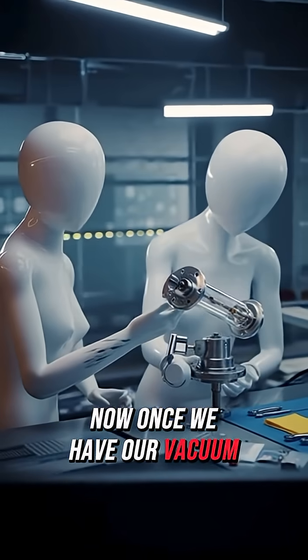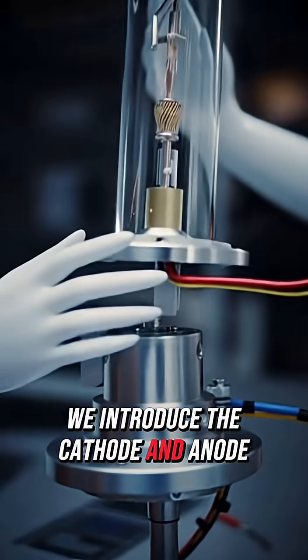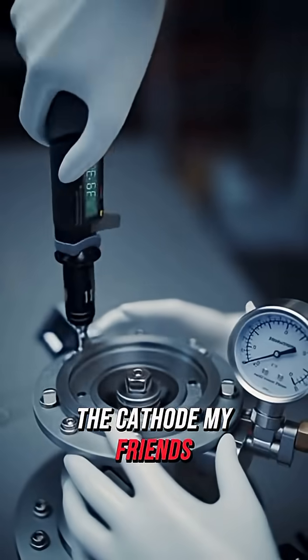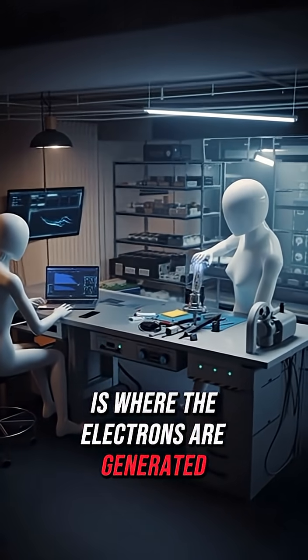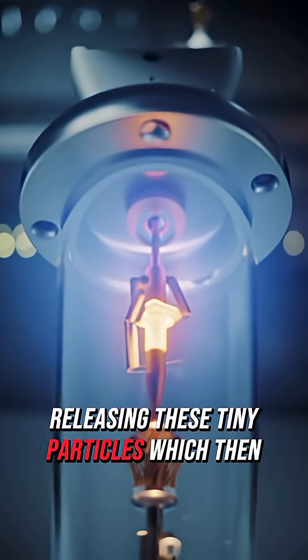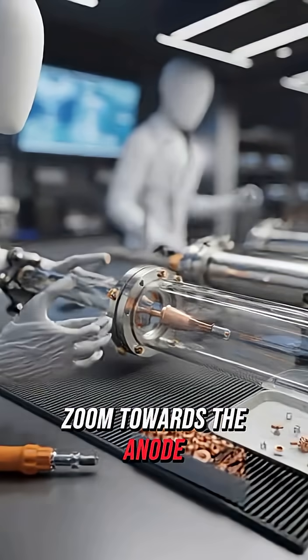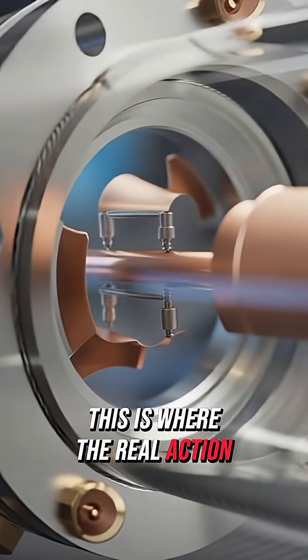Now, once we have our vacuum, we introduce the cathode and anode. The cathode is where the electrons are generated. It heats up, releasing these tiny particles which then zoom towards the anode. This is where the real action happens.